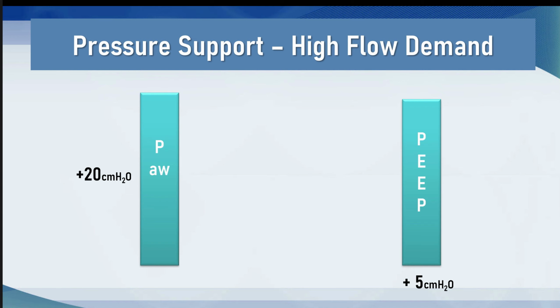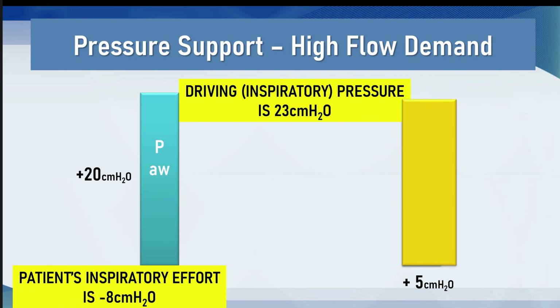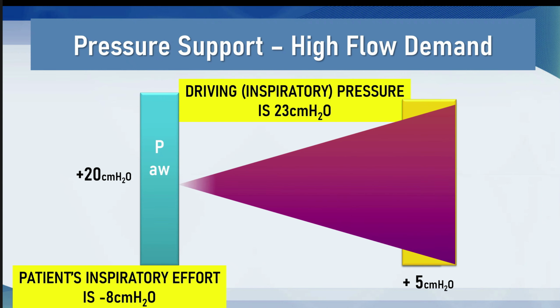In this scenario, the patient has a tremendous inspiratory drive below atmospheric, and this results in a very, very large inspiratory ramp and a very high tidal volume. We don't know what the transpulmonary pressure is, but it may be substantial. In order to measure transpulmonary pressure, you need to place an esophageal balloon in the patient and connect it to a manometer. The technology is not used in most ICUs and requires a fair amount of skill and precision, and actually, once you've measured it, a plan about what you're going to do about it.